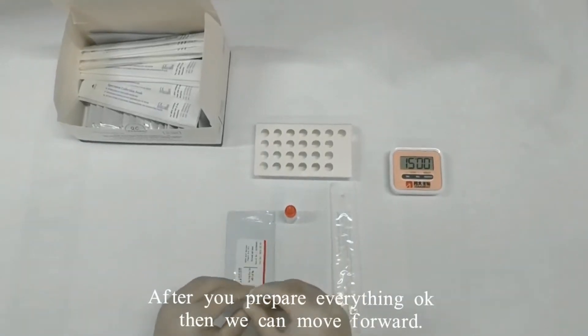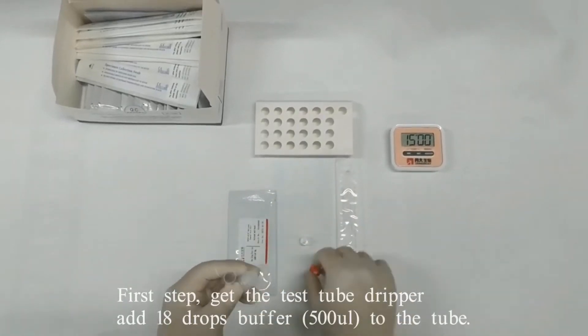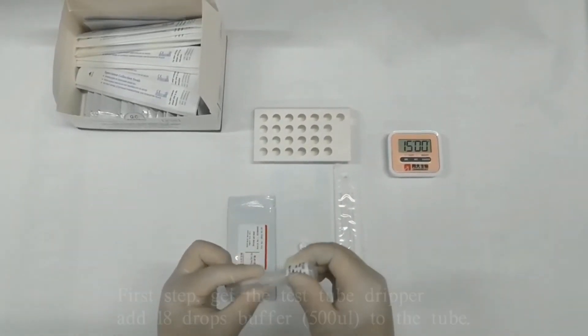After you prepare everything, then we can move forward. First step: get the test tube dripper and add 18 drops of buffer to the tube.